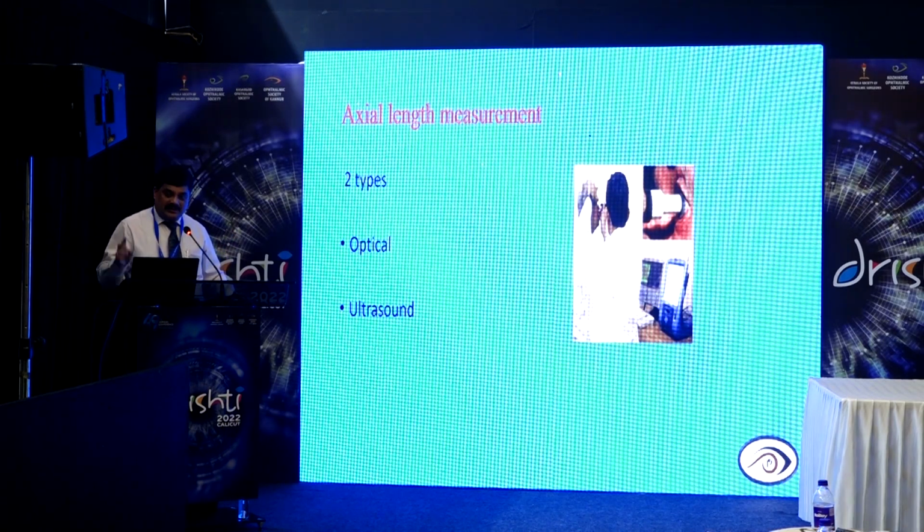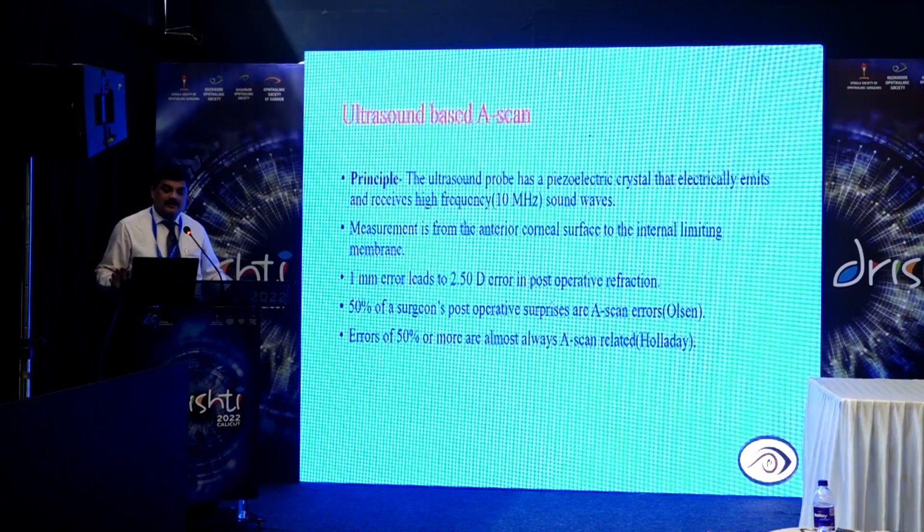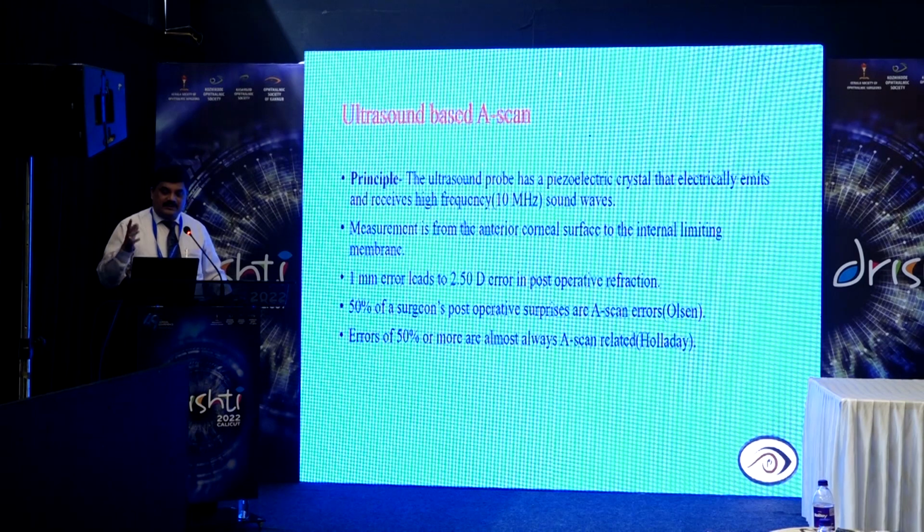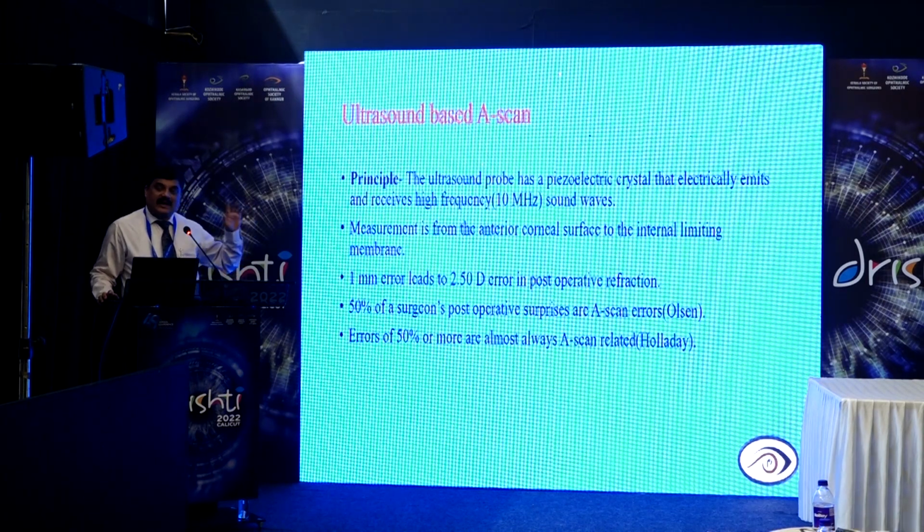So coming to the ultrasound A scan, most frequently done by all of us, the principle is the ultrasound probe has a piezoelectric crystal that electrically emits and receives the high frequency of sound waves. So normally what happens, the measurement is from the anterior corneal surface to the internal limiting membrane of the retina.